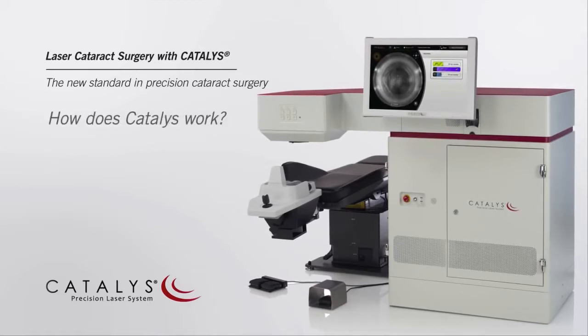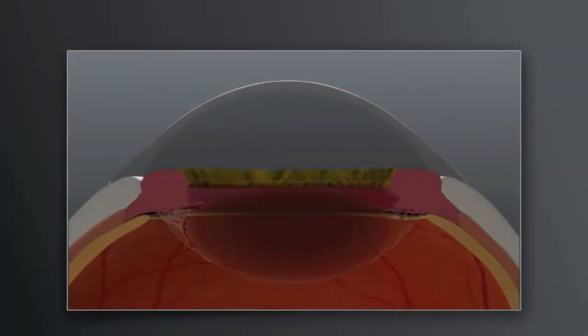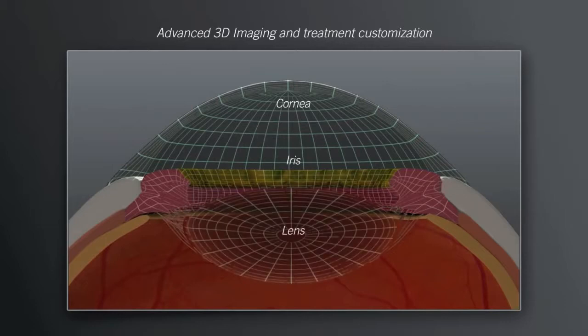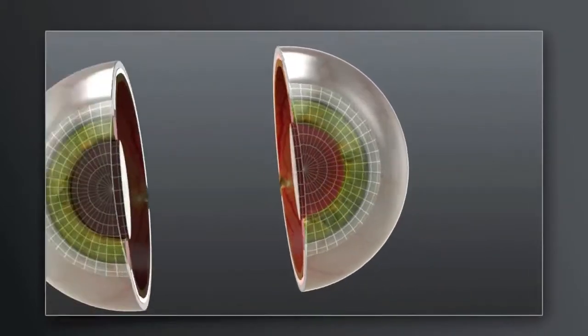How does Catalyst work? Every eye has a unique size and shape. Prior to treatment, Catalyst scans the eye, making a precise 3D map of relevant structures. This process enables your surgeon to create a highly customized treatment plan that is tailored to your eye.